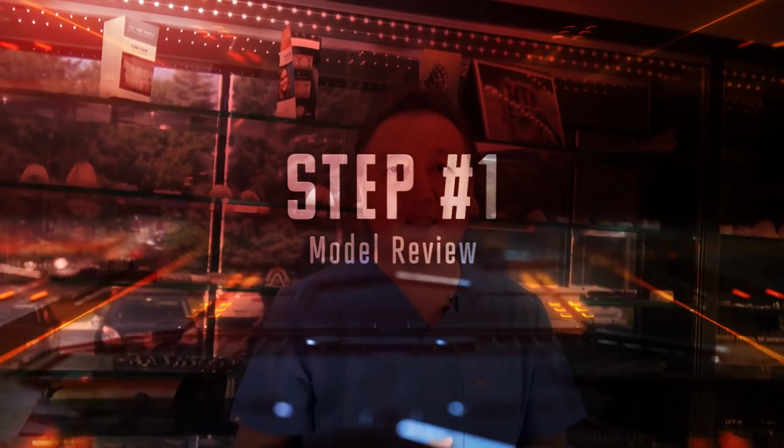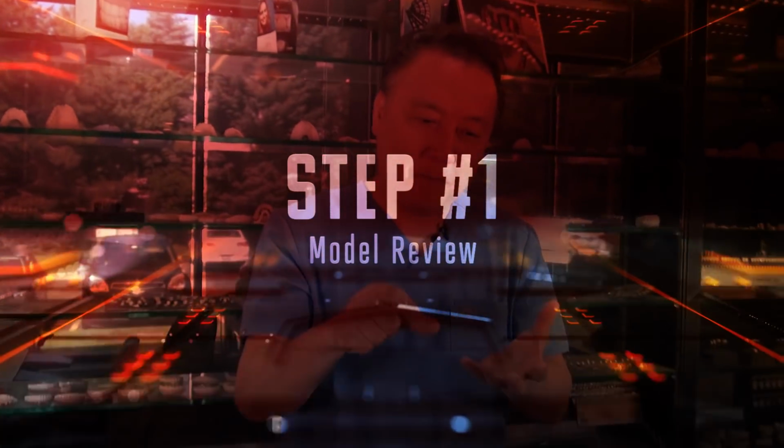Hi, I'm back. Regarding making good long-term provisional cases, number one, we have to see the individual model, looking at each tooth individually, and then mount it together properly. That's the number one rule. So mounting is very important. Why?